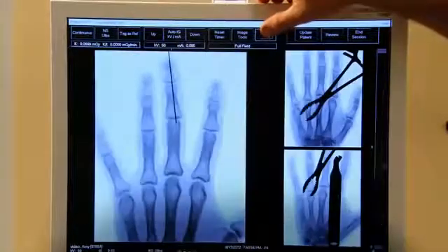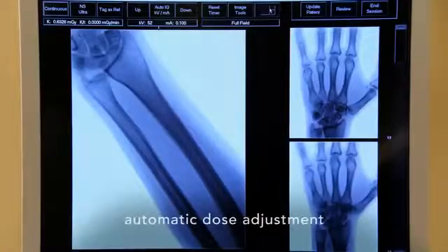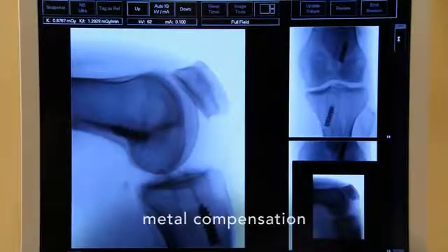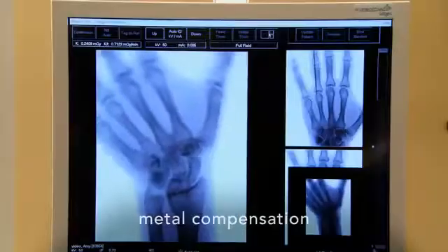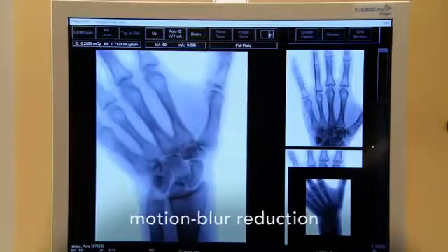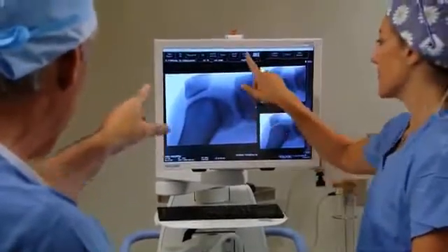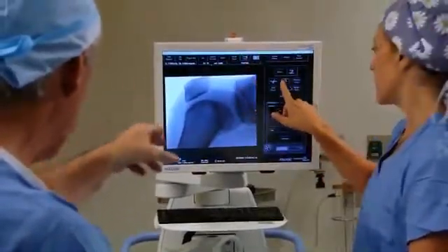The system automatically adjusts to deliver the lowest possible dose for virtually every imaging situation. It compensates for metal and reduces motion blur. The imaging parameters are easily customized to meet the individual surgeon's preference.